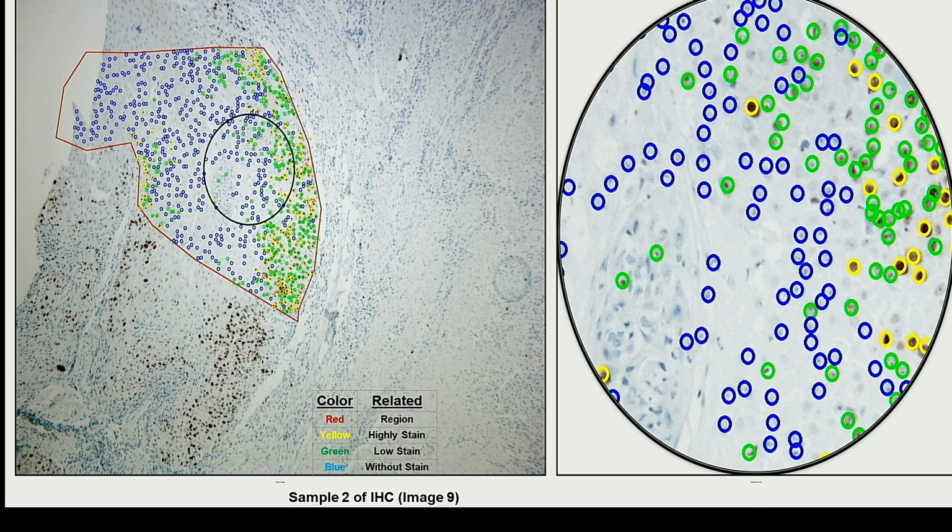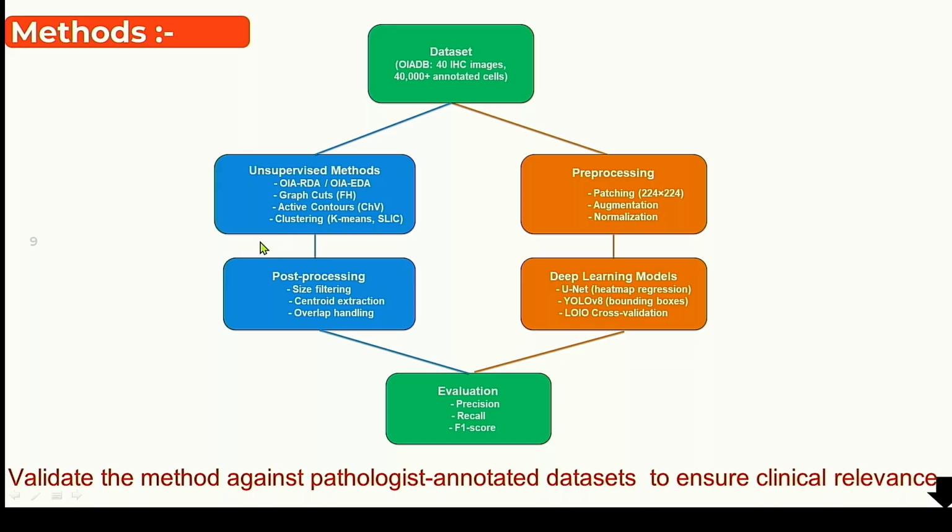Again, you can use the table to follow the staining level. Another thing is we can see the overlap between cells and different intensity between the images. Many problems we can deal with in that immunohistochemical image.